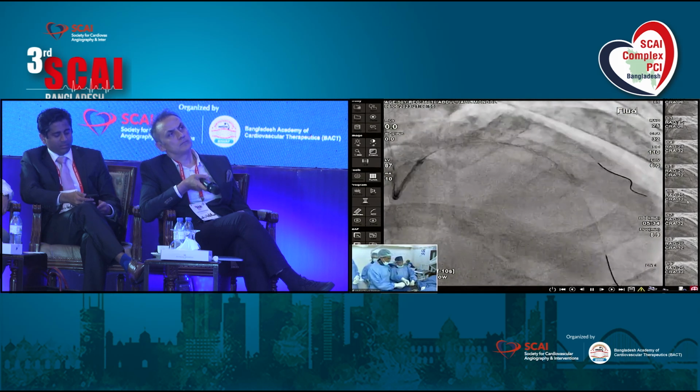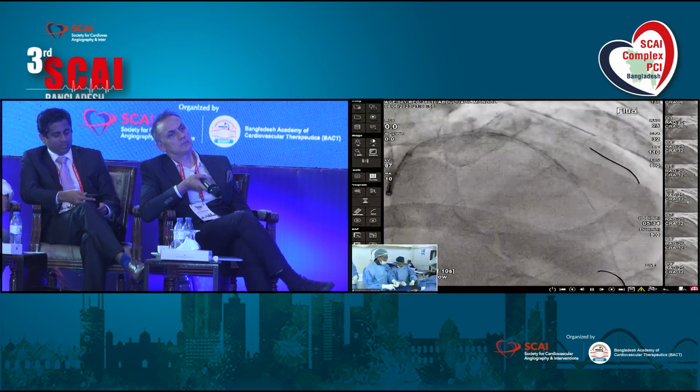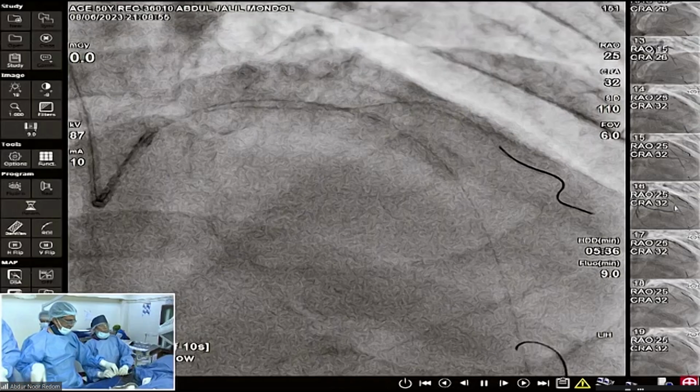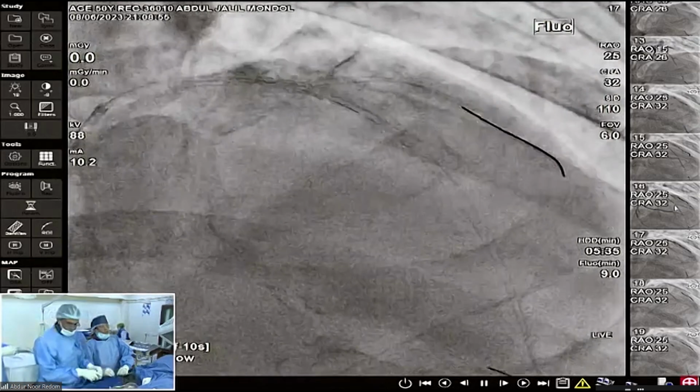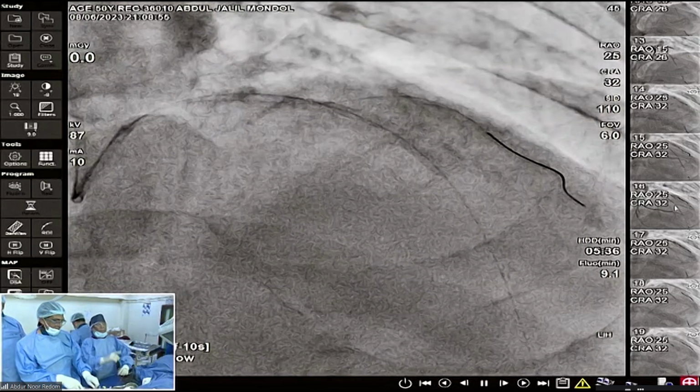Sir, stent size is 2.75 or 3? 3.0. Sorry, 3.0, then we shall start with 3.5. What is the opinion of the house? Shall we go with 4? Yeah, 4 I think is okay. We can also go with 4, and low pressure. Pressure is all right.